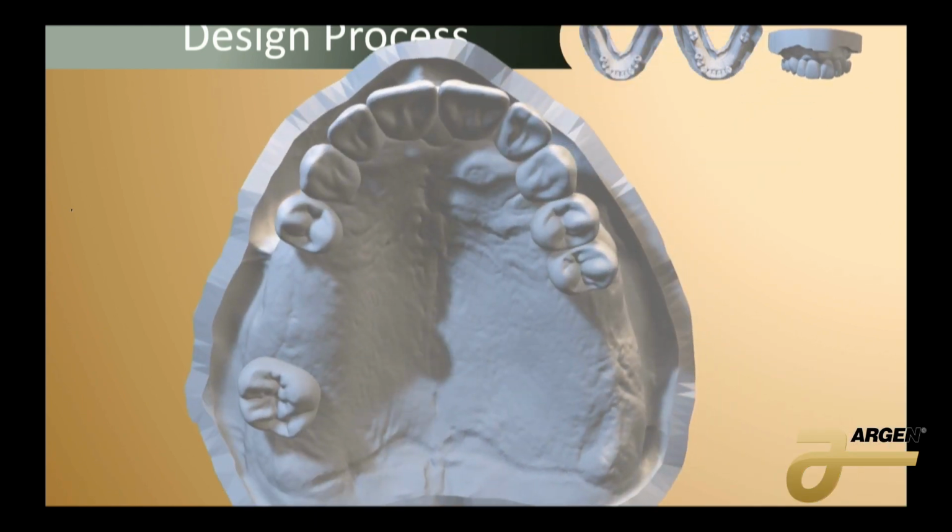Something like this here, we still have a fulcrum, but it has now moved kind of at an angle. So our fulcrum would be, depending on where we put our rest seats, say if we put a rest seat here, and we put a rest seat here, now our fulcrum line is here, across, right? There. So if we want to reciprocate, this fulcrum line has to be perpendicular.